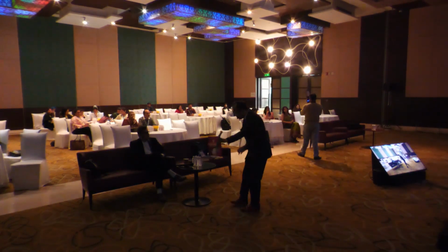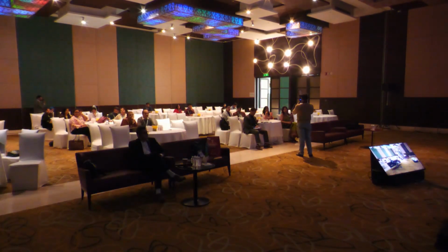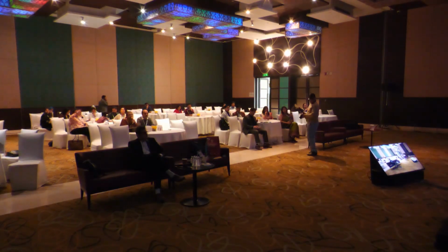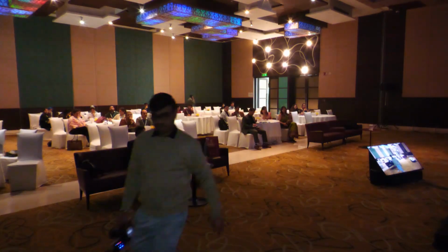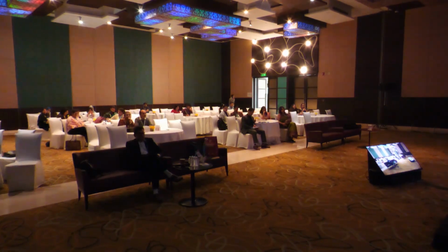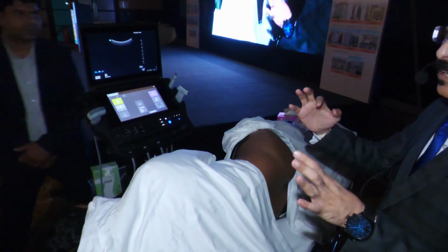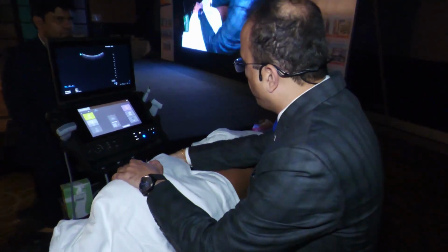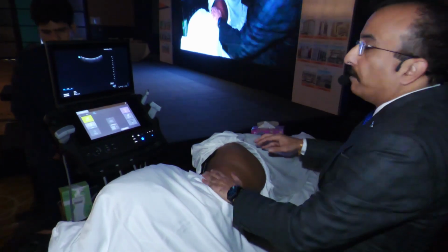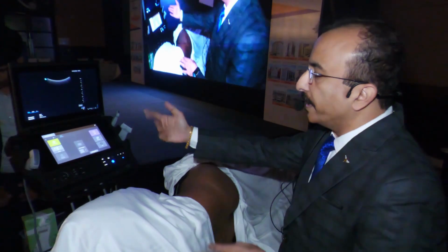Okay. So in order to perform these blocks, the patient has to be in lateral decubitus. He is well-built. What is your weight? 70 kg. So we are not showing you the ideal lean and thin kind of person. We are showing you what we encounter in our day-to-day practice. So the volunteer or the patient has to be in lateral decubitus position.